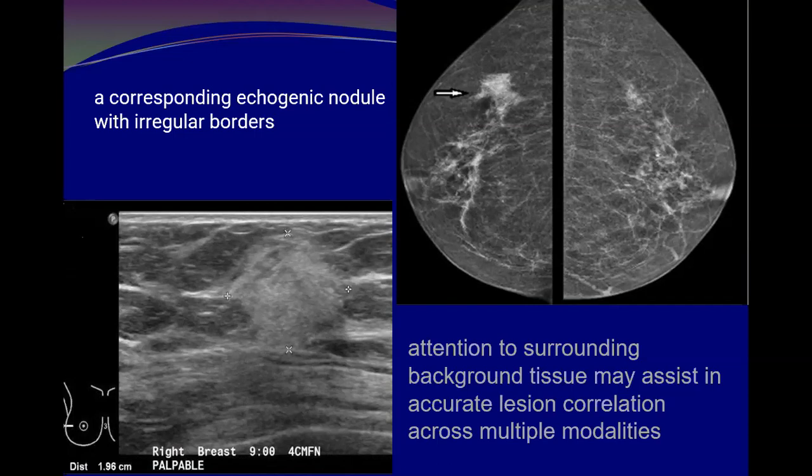90-degree lateral view, looking for a lesion, and sometimes just doing ultrasound and expecting the lesions to move in the same manner as on the 90 degree. If a lesion is lateral, what do we expect to move?